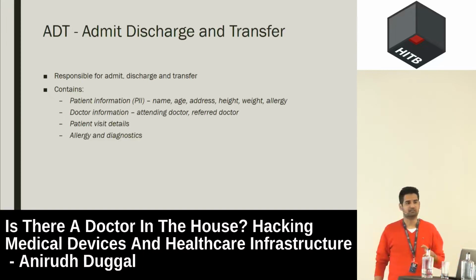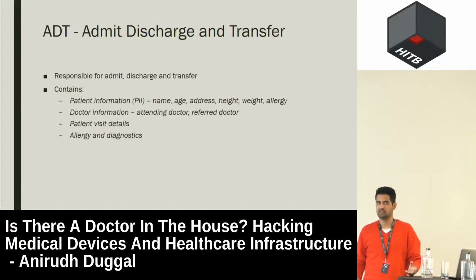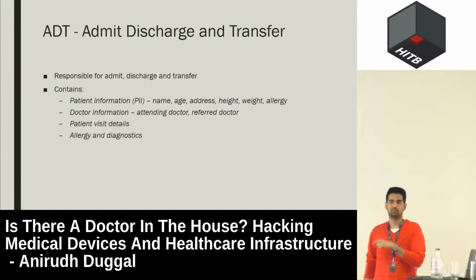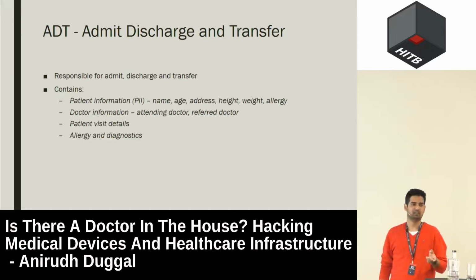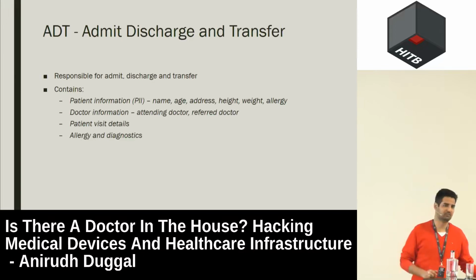This contains PII, and that is really important. So if you have a client in Europe or US, they will be really concerned about this information glowing in clear text on hospital networks, right? And this happens on most of the hospital networks that I've seen. Hospitals in US and Europe would get fined by the government for this. If you talk about countries like India or China, they won't. It's like they don't enforce stuff.